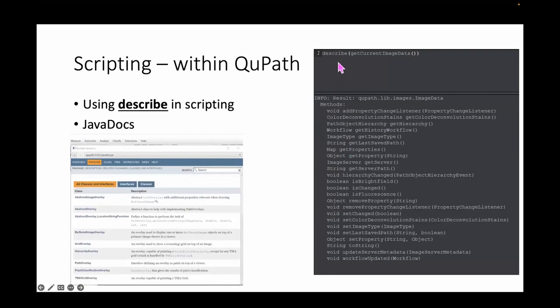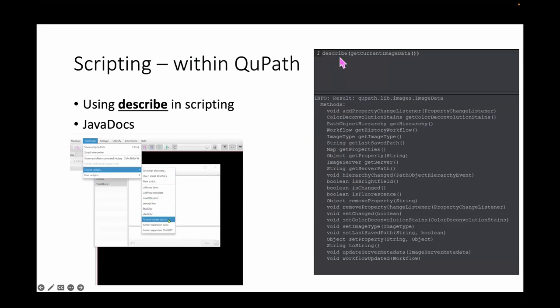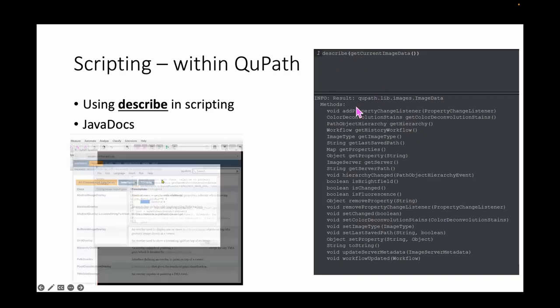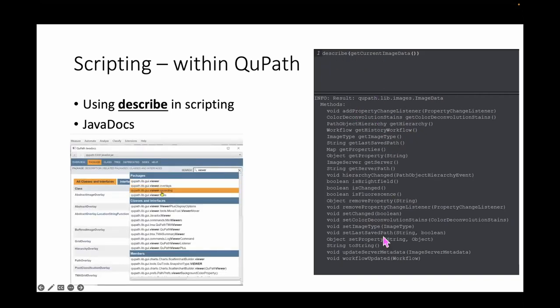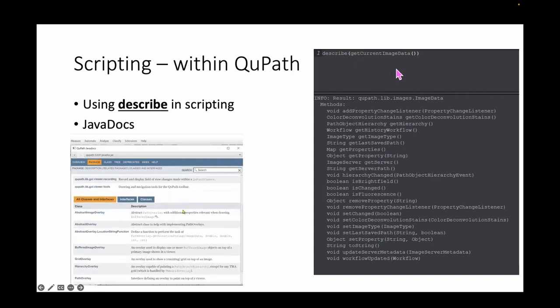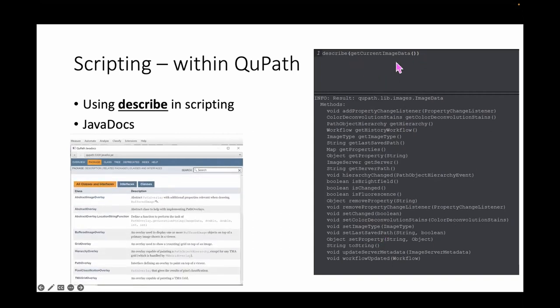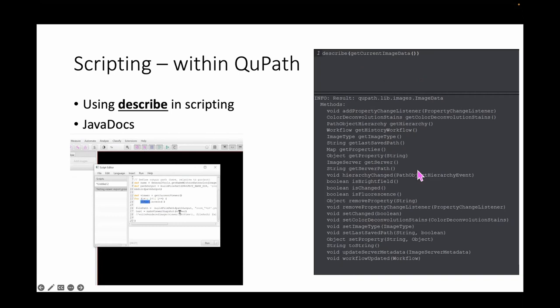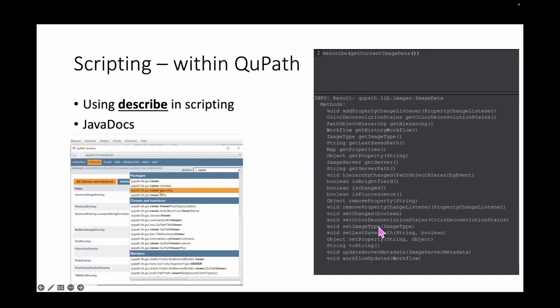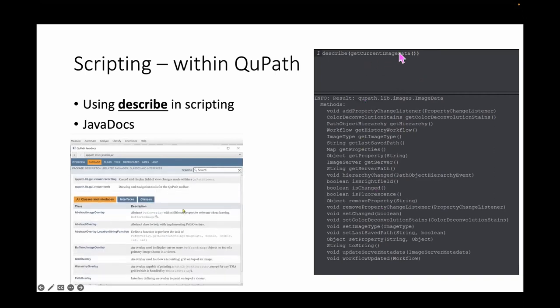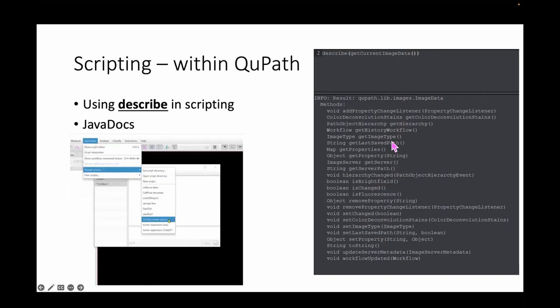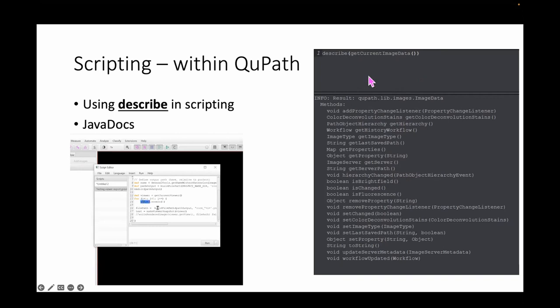Another thing I'd like to mention — this was amazing to me when I found it — is the 'describe' function. If you have a particular object and you're not sure what to do with it, you can describe that object and get an output showing all the different things you can do with it. One of the first things you'll see in many scripts on the forum is 'get current image data,' save that to a variable called 'image_data,' and then do image_data.getServer(). You can look through those lists, or do a describe on the server to see what you can do with that.